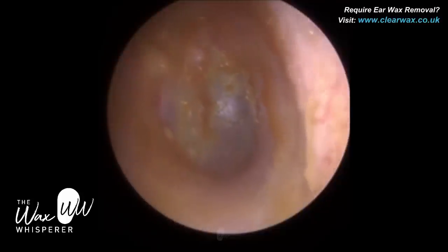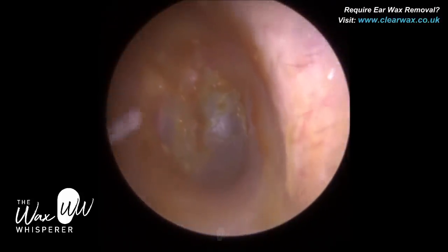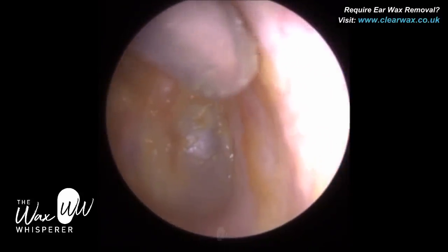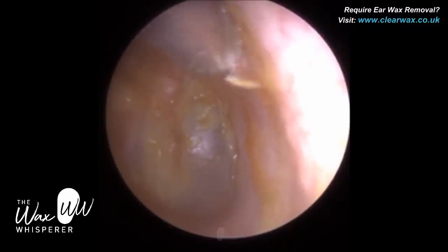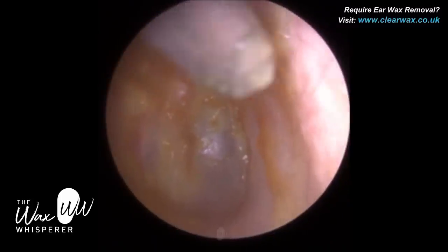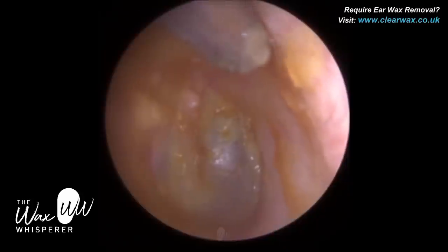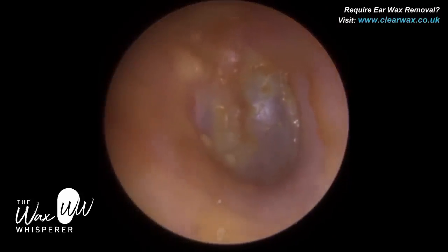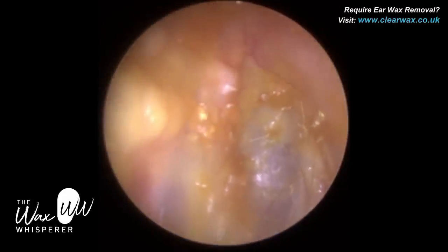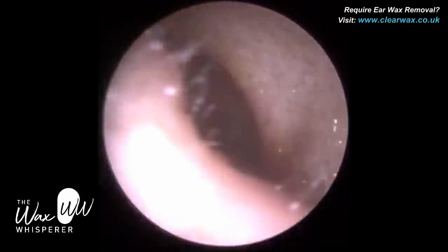So that enables me to make a bit of contact with the cartilaginous portion of the ear canal. With the fine-end, I wouldn't dare do that in the inner two-thirds — it would be very uncomfortable for the patient. I'm just hovering over this surface dead skin wax. If it comes off easily I'll hover over it, but I'm going to be careful because it can start clarinetting. It's not coming off easily, so just leave it. The patient's hearing is significantly better — they were completely deaf, couldn't hear a thing. There's a bit of residual sticky wax.